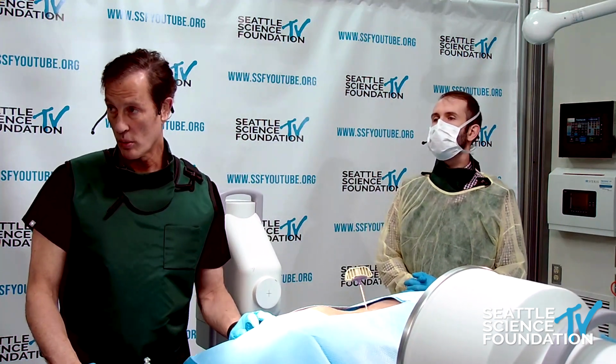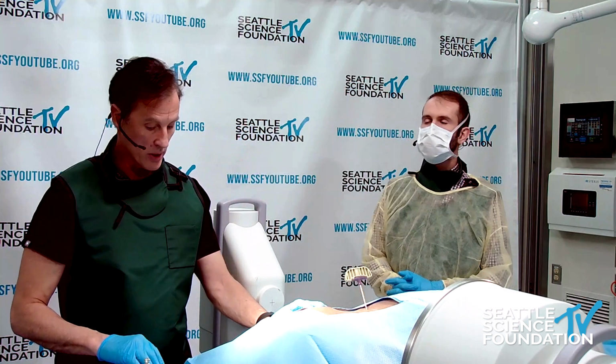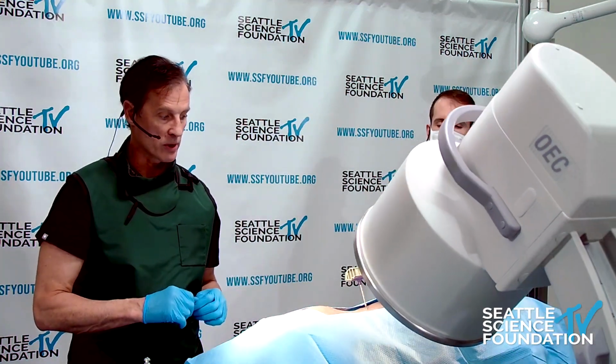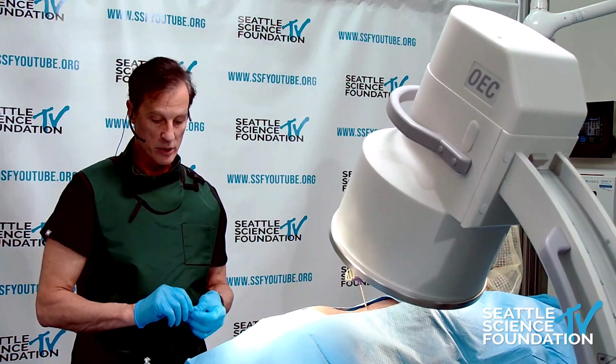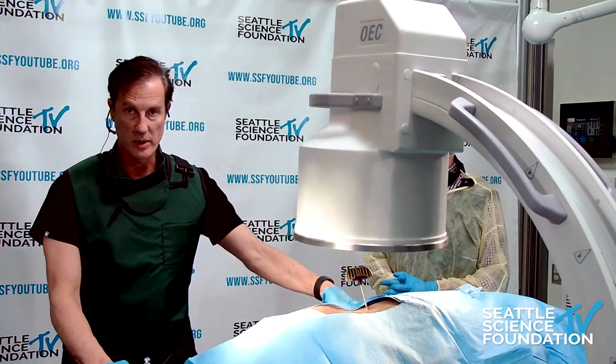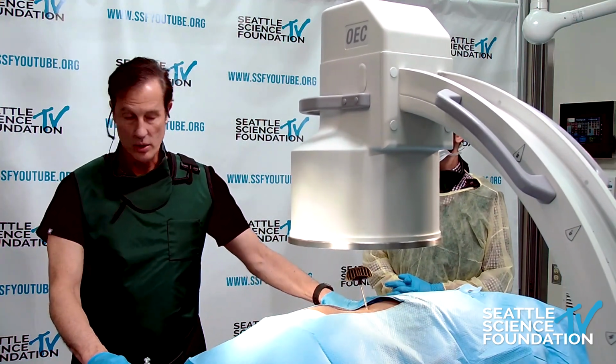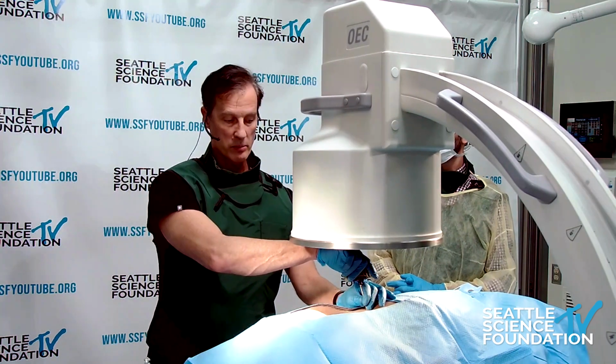And so we see we're not quite there, which is actually good. So we're about 3 millimeters away from the posterior wall, and we're not quite toward the medial wall of the pedicle. So the posterior wall of the vertebral body is just anterior to the needle tip. So we're going to come back around, and I'm going to show you why I like the bevel and the directional capability. So we're about 3 millimeters away from the posterior wall. We're also about 3 millimeters away from the medial wall of the pedicle. So we'll take a shot here. So we're equidistant. So it kind of means we're in the middle of the pedicle.